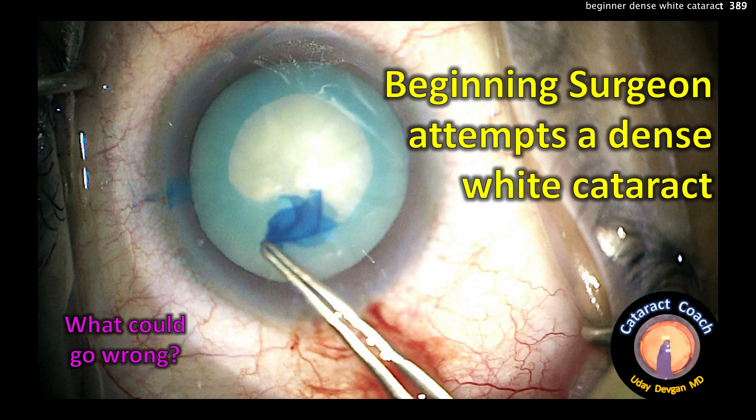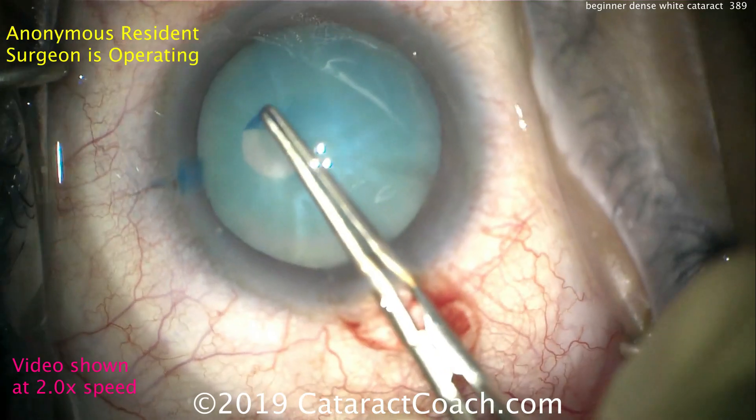CataractCoach.com. A beginning surgeon attempts a dense white cataract. What could go wrong here? Let's watch this case.